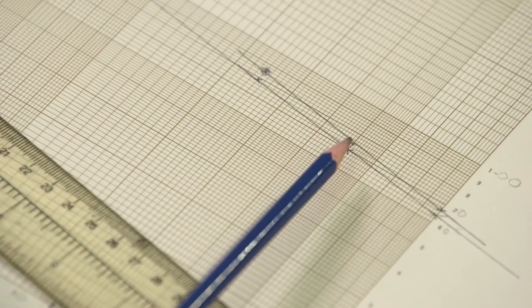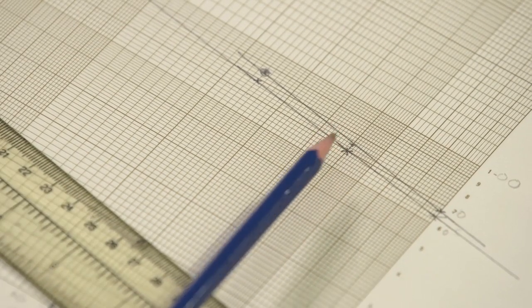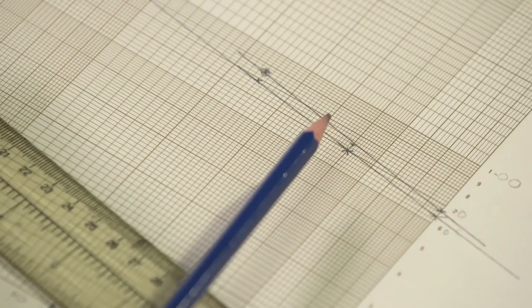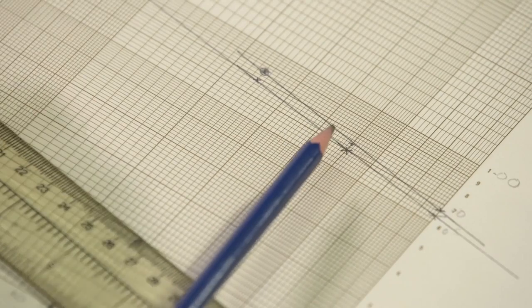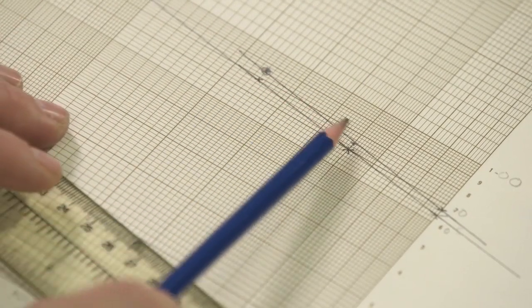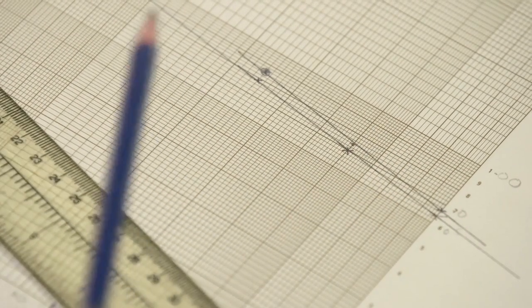And again, this is a feature of the assay that even a very small difference, 1 or 2 seconds, can start to move this line substantially in terms of the location on the graph paper. So we need to take some care in the plotting. So this is the IQC sample. Straight line, parallel to the standard.